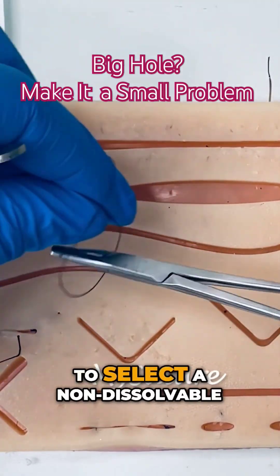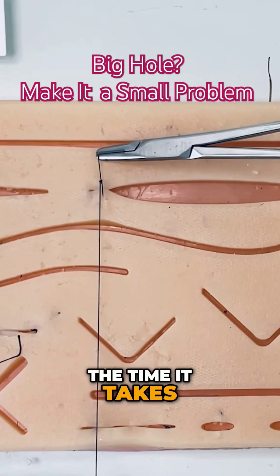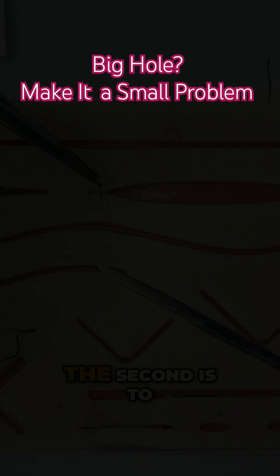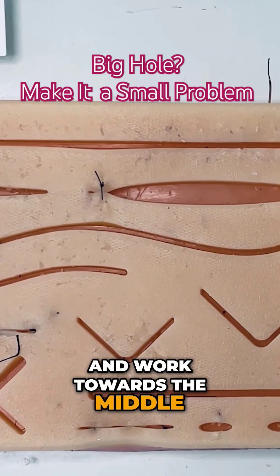The first technique is to select a non-dissolvable suture in order to control wound closure over the time it takes for the wound to heal. The second is to start at the apices and work towards the middle.